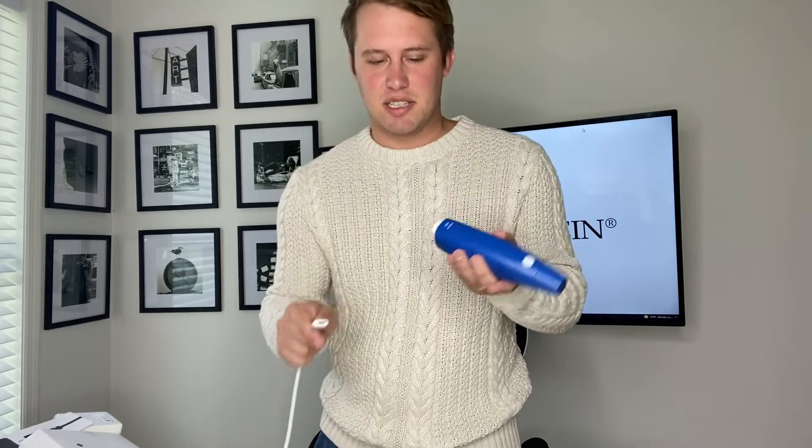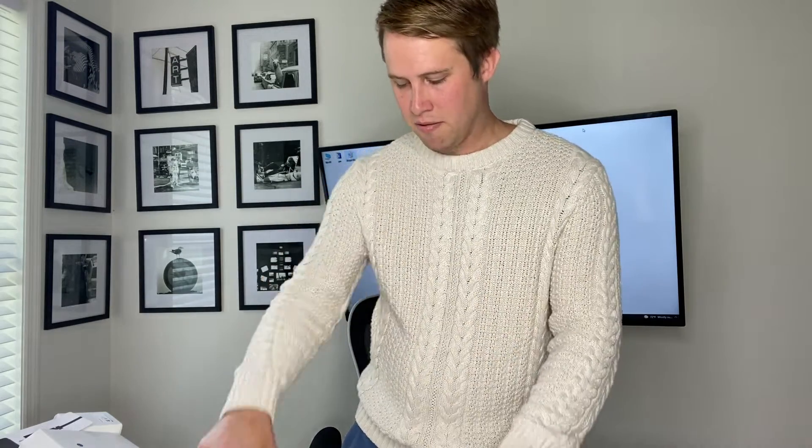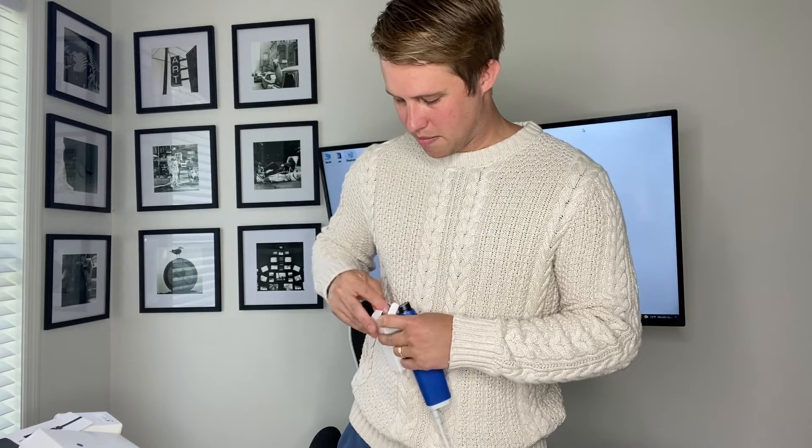We have our USB-C connection cable here - we're going to plug that in, and then this will have scan tips inside. It has a USB plugin, so if you need to load Medit Link software you can do so off the USB that it comes with. And it has four scanner tips. Pop one of these on, remove the protective scan tip cover, and pop our scanner tip on.